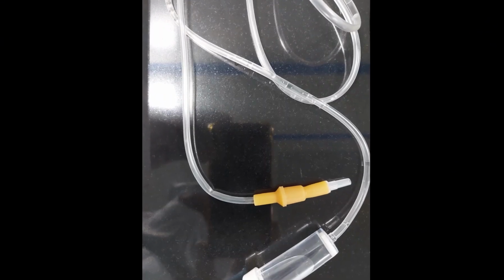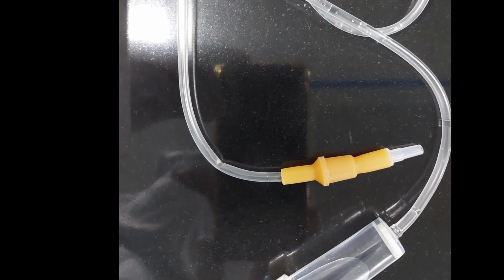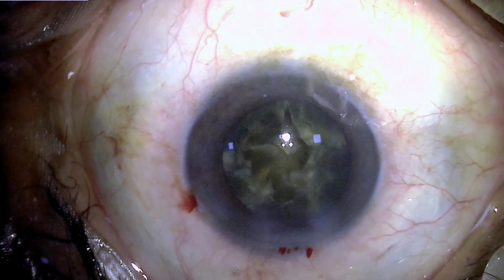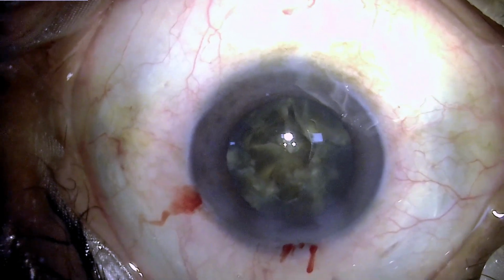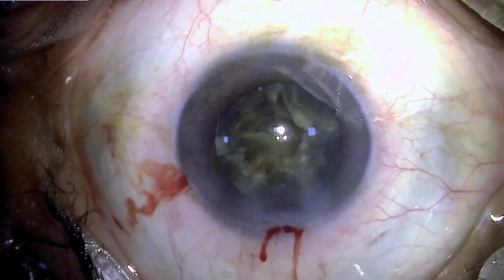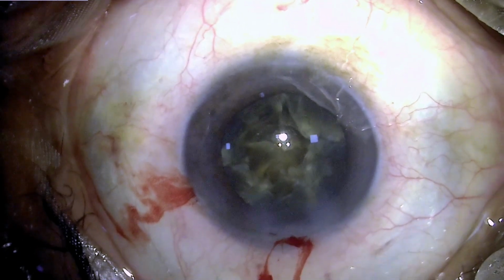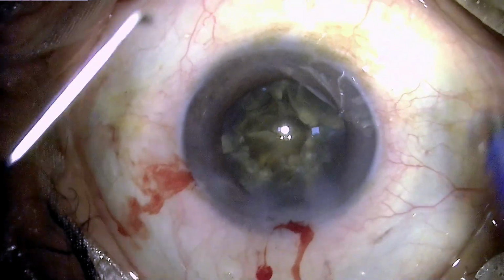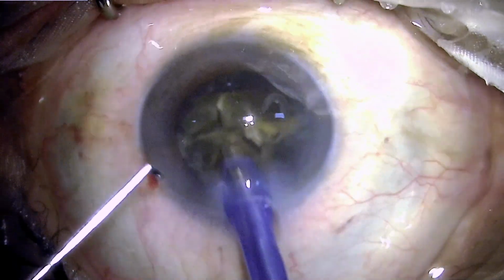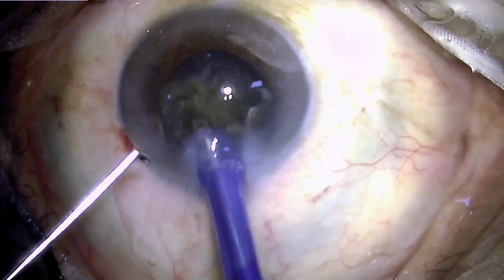And by inspecting the tubing, we can see that this time at the distal end of the tubing where it is being connected to the phaco tubing, there's a kink here which is causing limitation in the inflow. So I am waiting here. This is the fast forwarded portion, and here I am waiting for the tubing to be replaced by a fresh IV line with no faults. So once that has been done, we proceeded to emulsify the pieces which were already dismantled during the earlier portion of the surgery, and we will simply see that this surgery is completed now.